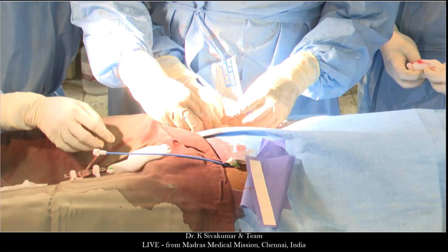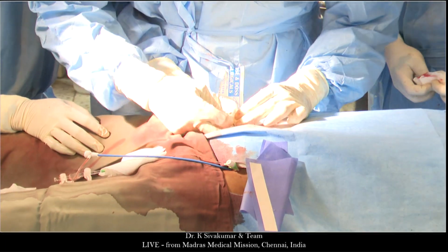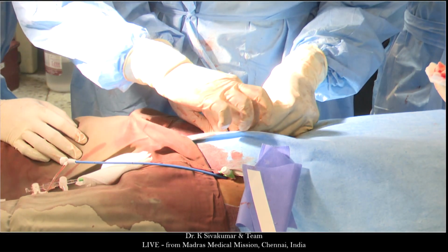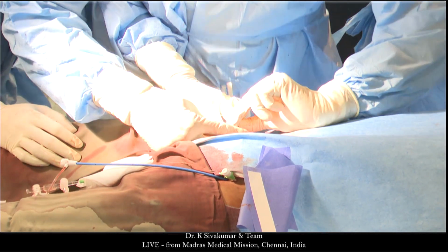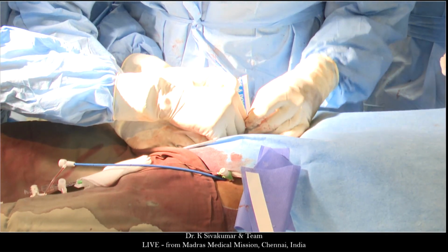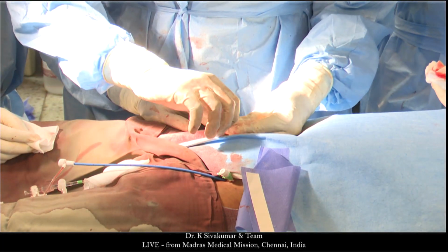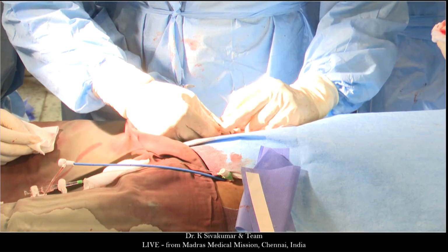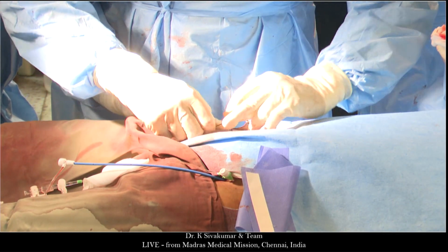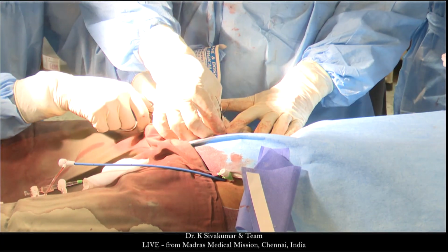In covered stent embolization, we have had it in 5 of our 135 patients. 3 of the patients happened after we removed the guide wire circuit, and these 3 went straight away for surgery. In 2 of the patients, it happened while the vein circuit was still present, meaning I had a stiff wire running into the right jugular vein. In these patients, I put in an additional overlapping stent, and I was able to rescue the patient without sending them to the operating room.